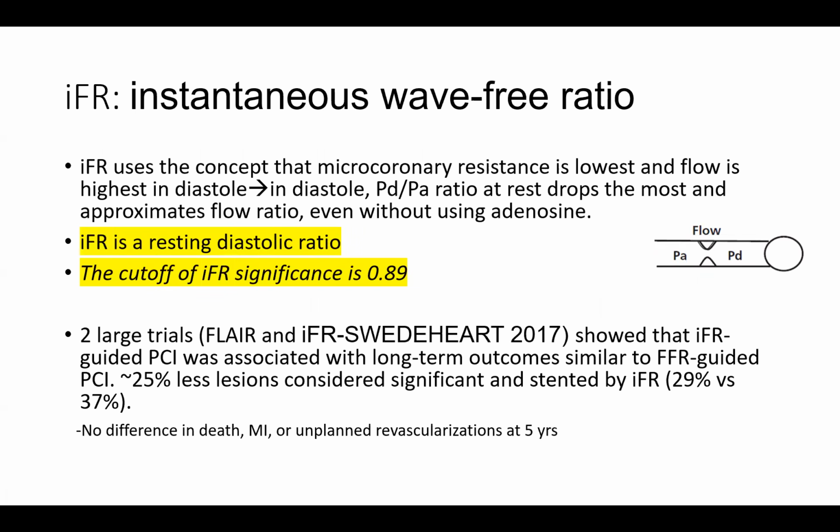Now, I will move on to describe the iFR, that other very important index that is more commonly used today than FFR. It's the instantaneous wave-free ratio, iFR. So what's the concept?